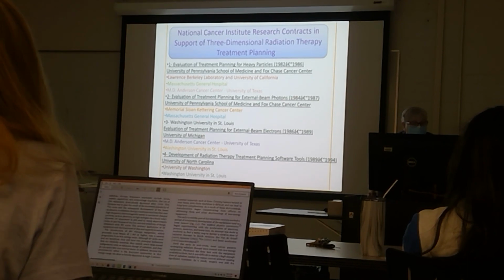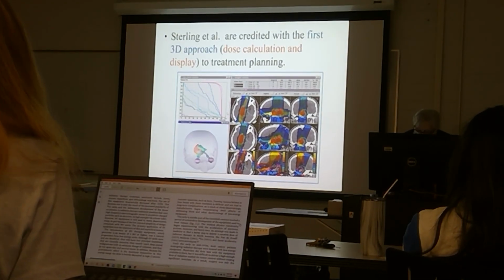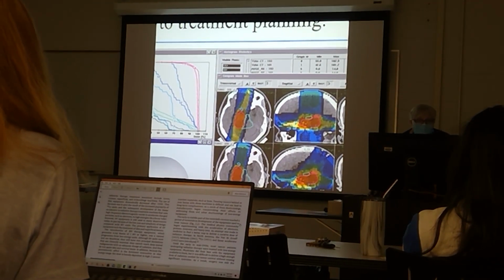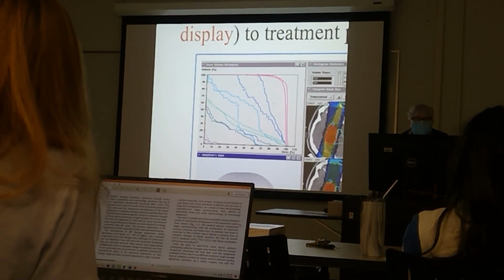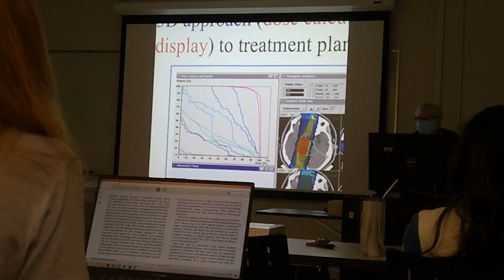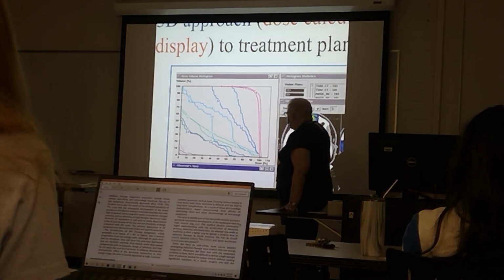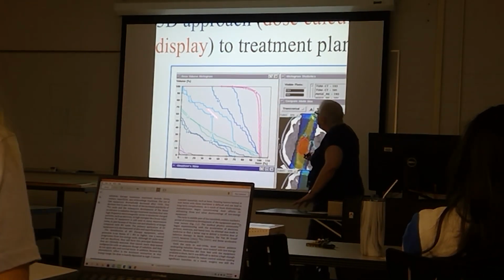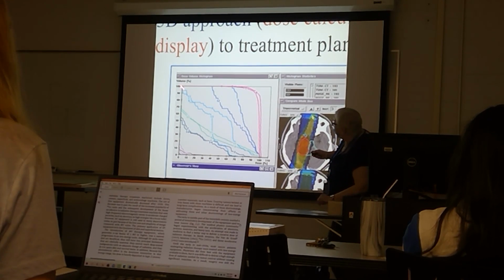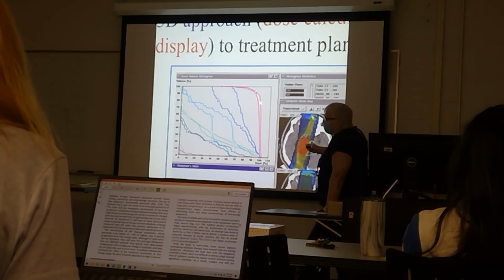Guessing it's related to the dose, but... It is. Let me just see if I can enlarge it a little bit. Is it based on color according to the field? No, it's not, actually. It's called a dose volume histogram. And what that does is you usually have a color code. So my guess is that this is the tumor dose.